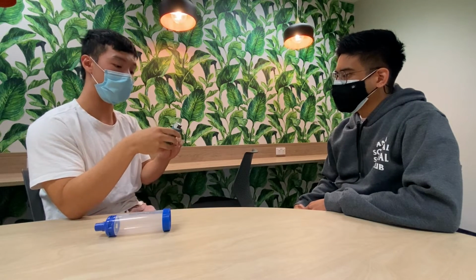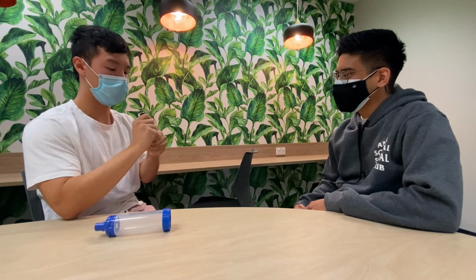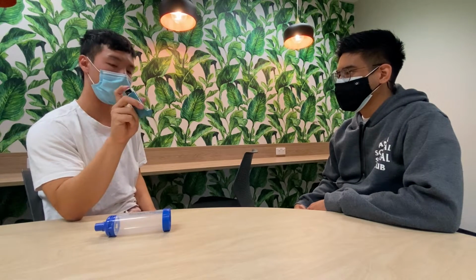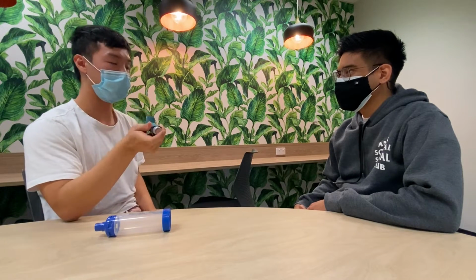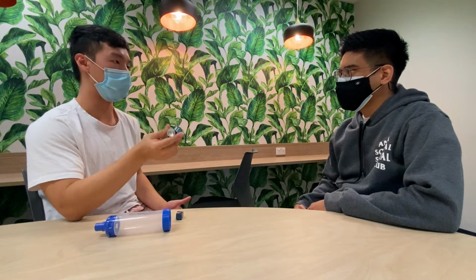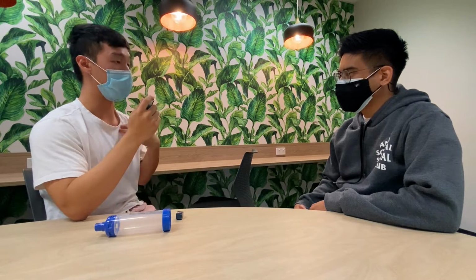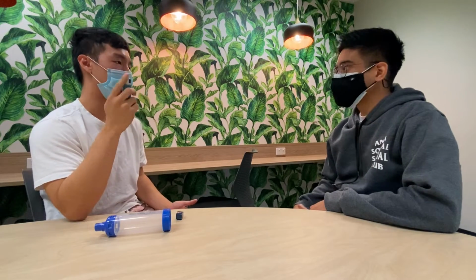So how you use it is you would open up the cap like this. If this is the first time you're using the inhaler, you need to prime it twice, so you hit it twice. Exactly like that. Now, without the spacer, how we'd use the Ventolin would be to have a firm grip over the mouthpiece here, spray and inhale at the same time, hold your breath for 5 seconds, and then remove the inhaler and just breathe normally.